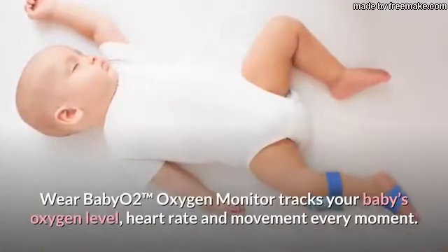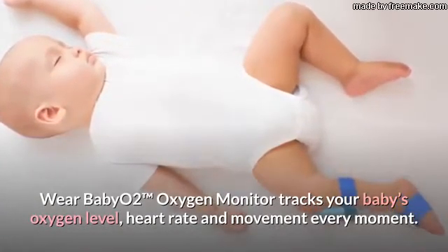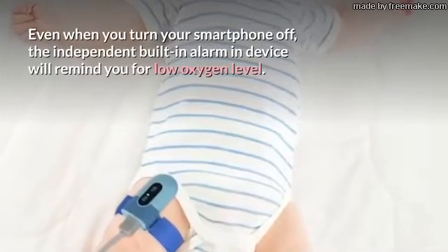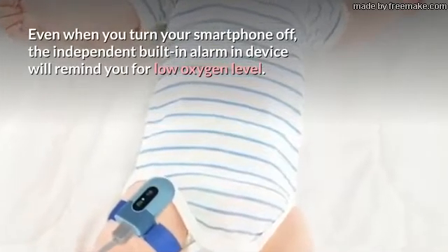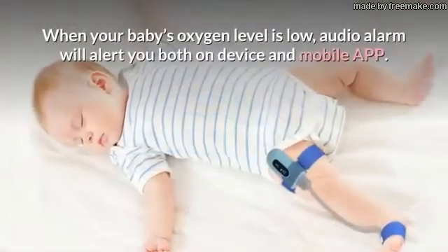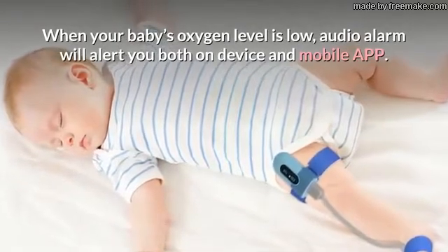Wear Baby O2 Trademark Oxygen Monitor tracks your baby's oxygen level, heart rate and movement every moment. Even when you turn your smartphone off, the independent built-in alarm and device will remind you for low oxygen level. When your baby's oxygen level is low, the audio alarm will alert you both on device and mobile app.